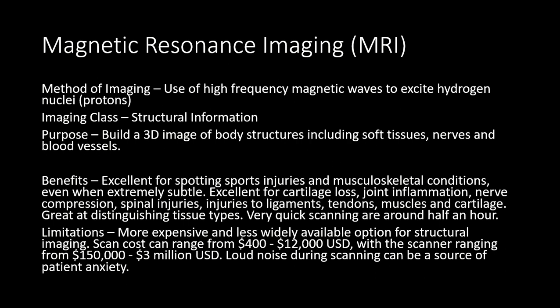Now, each scan, depending on how good of a scan it is, can range from $400 to $12,000, with a scanner ranging from $150,000 to $3 million. Loud noise during the actual scanning can also be a source that causes patient anxiety, as a magnet is being spun very quickly around you.